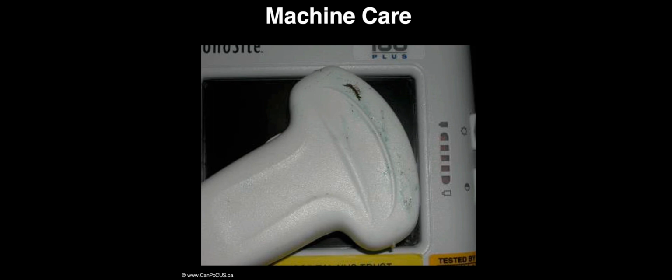The machine, handles, knobs and buttons should also be thoroughly disinfected after each use. By doing this, we are following infection prevention and control standards, but also improving image quality and prolonging machine longevity. Always think of the next person using the machine. Make sure you leave it in a condition in which you would like to find it.